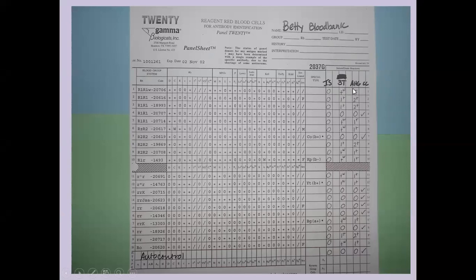One thing I want to point out to you guys, and when you go through this, you're going to see this yourself, but let's look at cell 1. Okay, so cell 1, patient reacted plus weak, and then the reaction bumped up to 1+ with AHG. But when we look at cell 2, we see that this one reacted stronger at 37, 1+, and bumped up to 2+. So what could be explaining why some of these cells are 1+ going to 2+ and others are plus weak going to 1+?